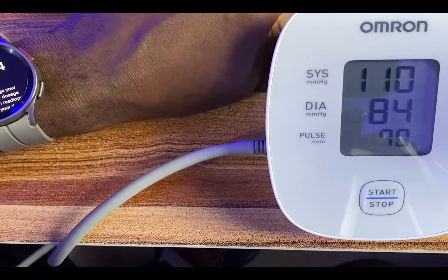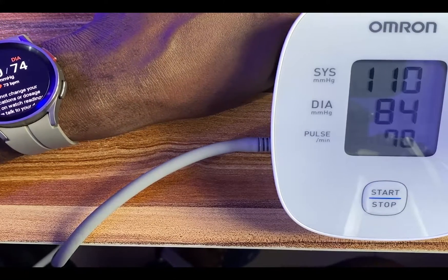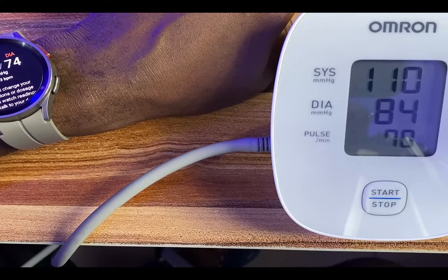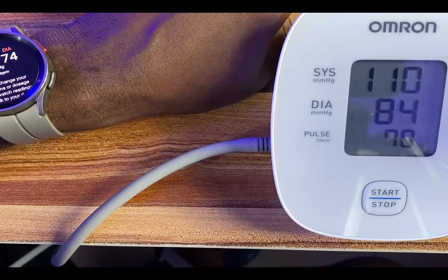So that is what you get as far as blood pressure measurement is concerned on the Galaxy Watch 5 Pro. Based on this, I can say that the Galaxy Watch 5 Pro actually does a pretty good job as far as measuring your blood pressure is concerned.